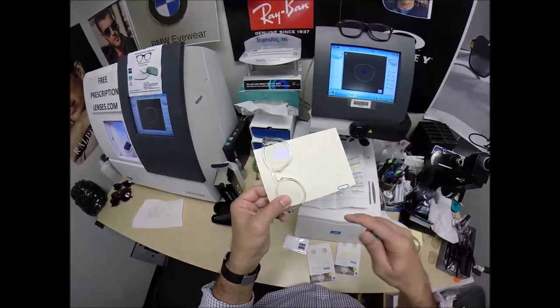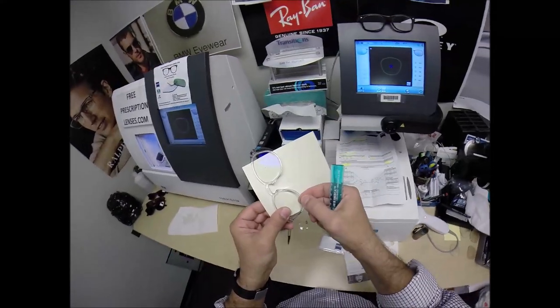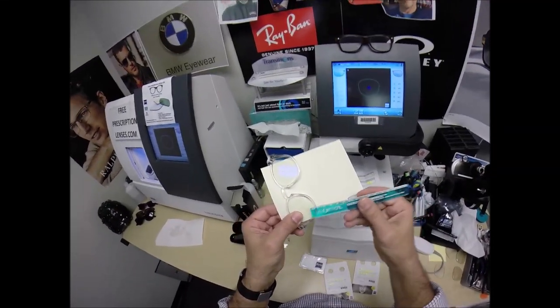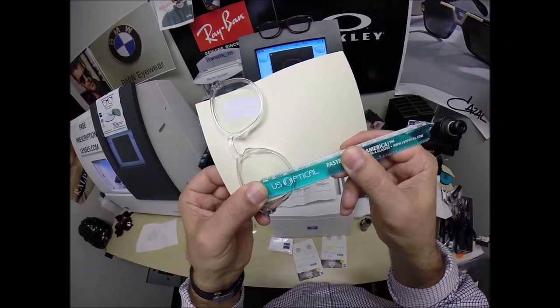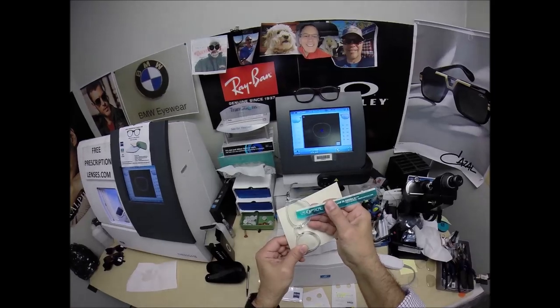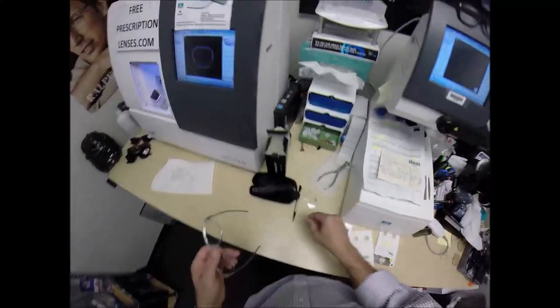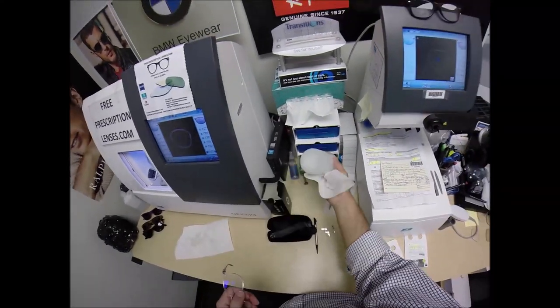That is cut perfectly. Optical center height is not to the bottom of the lens, but to the middle of the plastic, because that's actually where the lens goes down into. That is the deepest portion of the lens, which you can actually see in this frame, 24. Now one more part in the final inspection is to make sure your frames are in standard alignment.